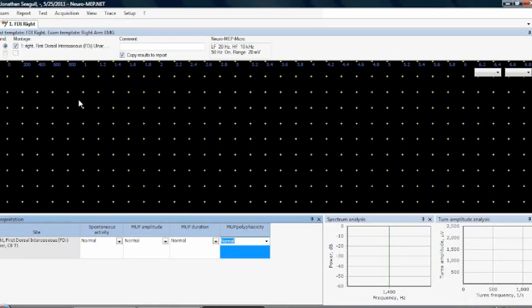Once you have that screen, now you stick the needle in the muscle and you ask the subject to activate the muscle, and I'll show you what it looks like in a minute. And then you can acquire and save the potentials, copy them, paste them, do a lot of stuff. But basically, you just do a routine needle exam. Once you're done with this, you press test next.